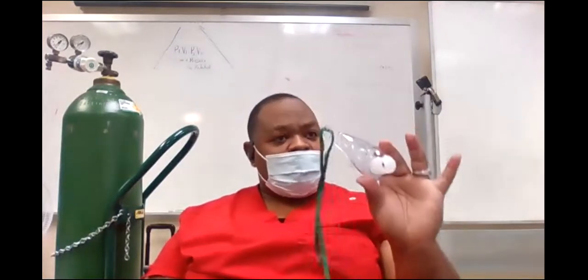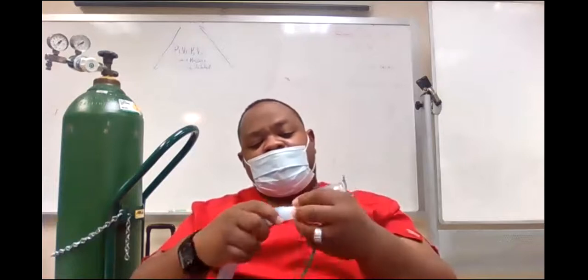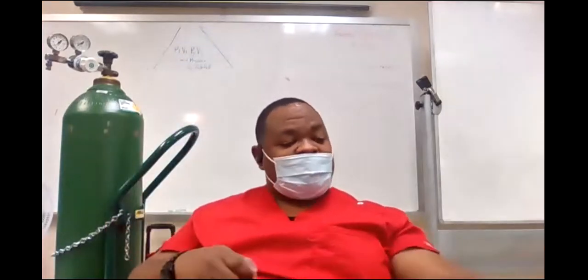But for my class, I'm going to say trach collar because that's what I'm used to, okay? This is a trach collar, all right? It's just like a collar for your trach. If I put this trach collar on here, that ain't hard, is it? This is it, okay?